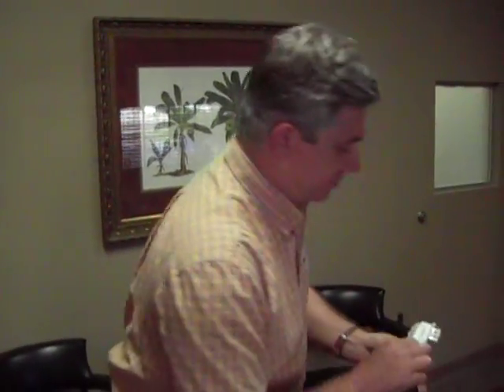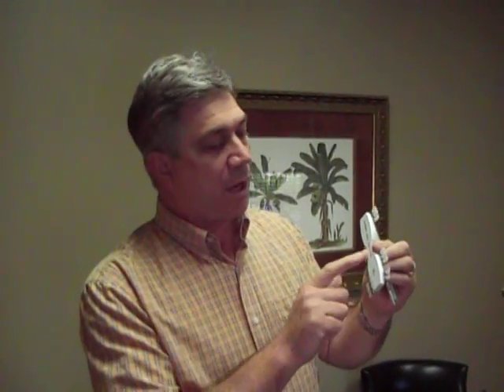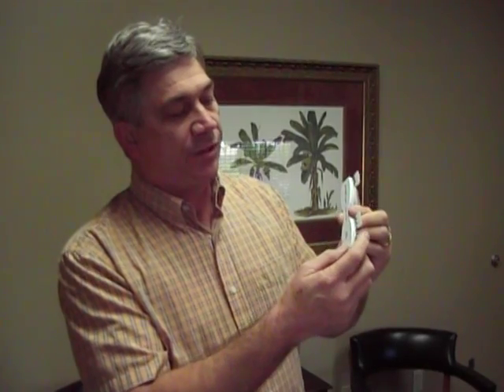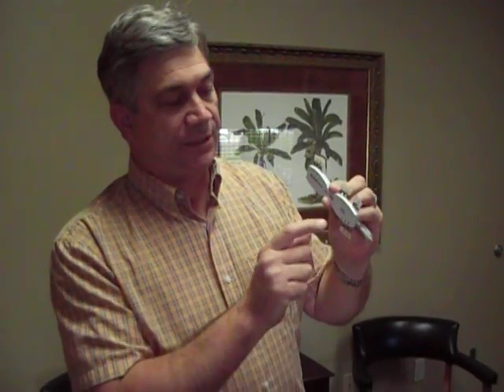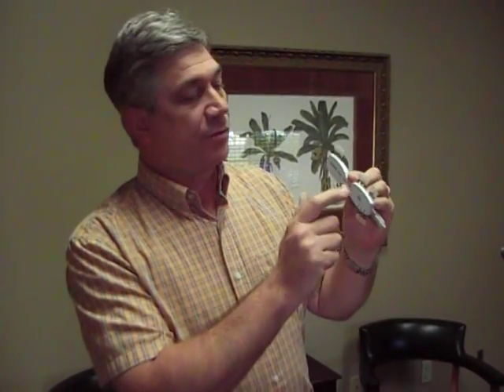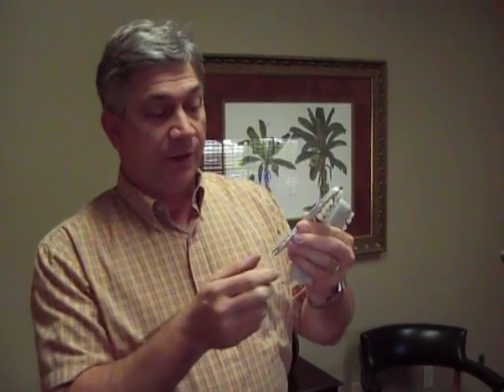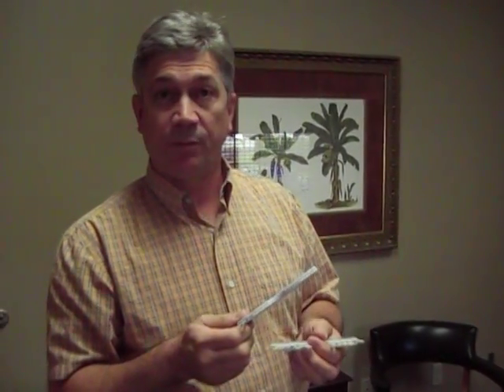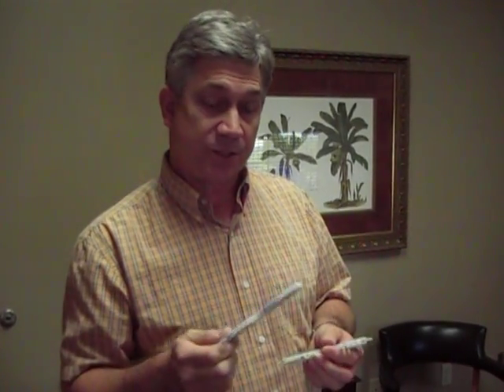Here are incisal tabs. Each bottle of porcelain, each one of these represents a bottle of porcelain. It'll show you how much translucence is in that tooth. A translucent tab, a neutral tab, translucent 1, 2, or 3. You just put that up to the tooth, and if it's in there, it's going to show you if it's in there. And you just pick out each tab for that tooth that's in there. If you're doing a single central, it's imperative that you have these tabs for the porcelain that your laboratory has.